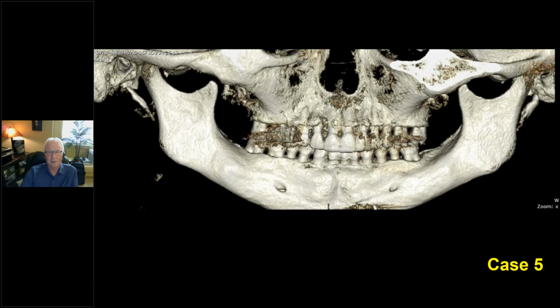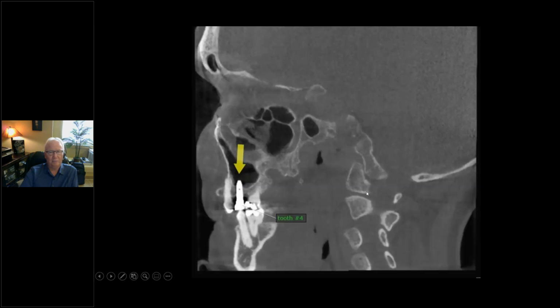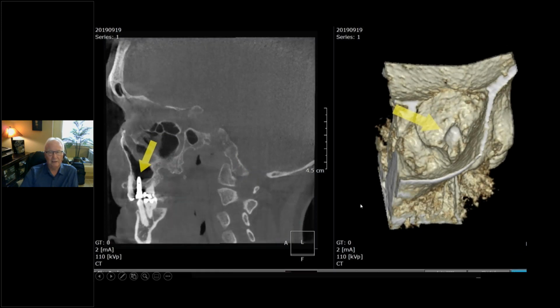Okay, I had to see what this one almost looks like the last case all over again. But if you look at this one, you can see an implant. You follow the antral floor on both sides. Maybe there's some inflammatory change. I don't know. You can do radiographic interpretation, but you can't make a good clinical impression out of this. You see it in a different plane of section. This is a sagittal view. Tooth number 4 has penetrated. And there it is again in the antral space.